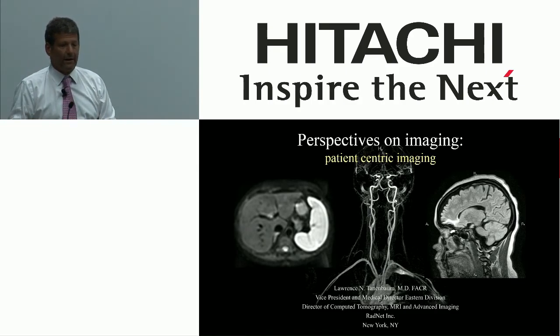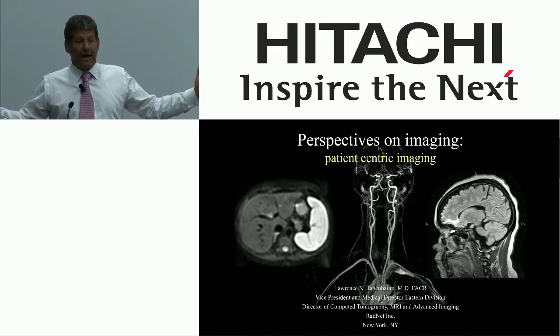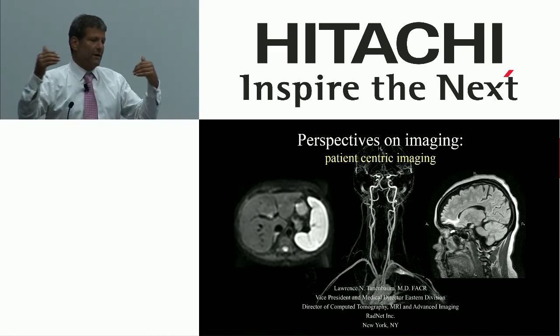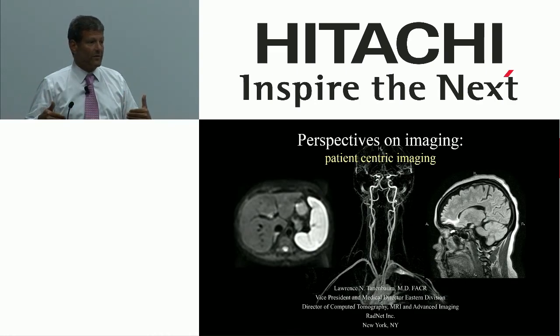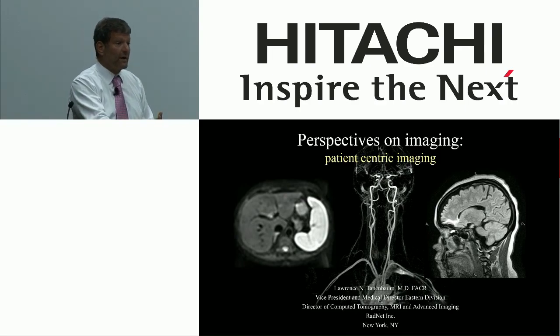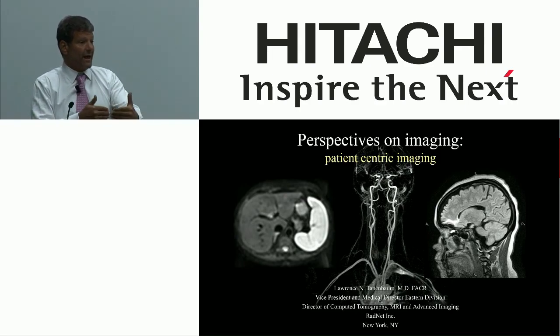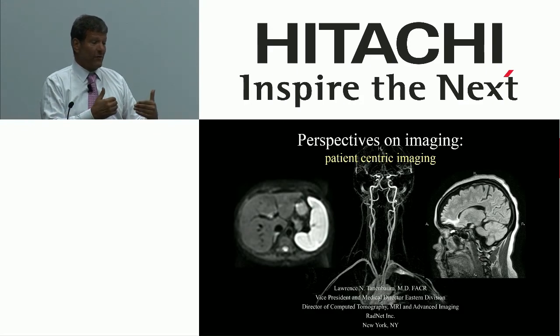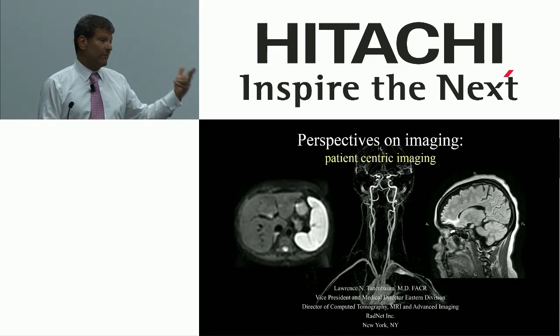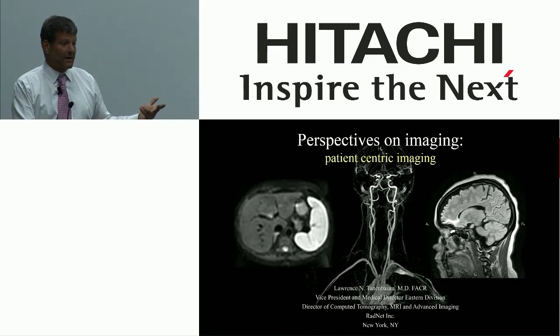We went right back in, and 2.5 minutes later, the machine was clicking again. When we knew that the scan was about to end, everybody in the facility knew, and they were standing by. Staff was always ready to get the patients off. But in New York, we don't have that. I haven't been able to make that kind of a change yet. So in reality, we have about 5 minutes of preamble and about 5 minutes of transition on every single exam. If I can get down to 2.5 minutes, I can increase the value of that exam, scan more, get the patient off faster, and survive when the government continues to come down upon us over the next couple of years.